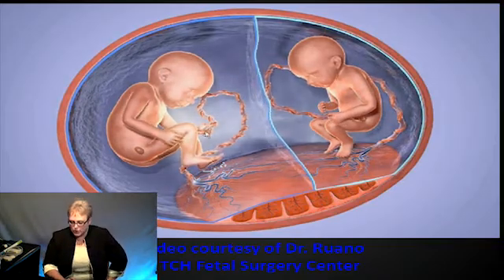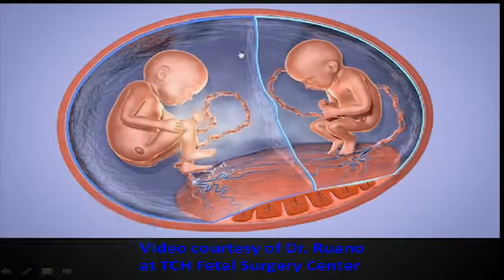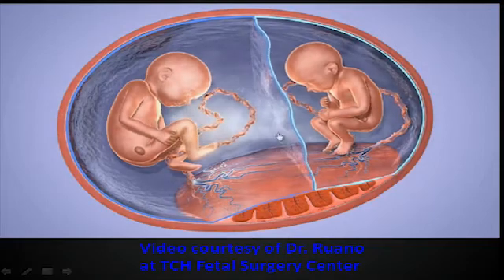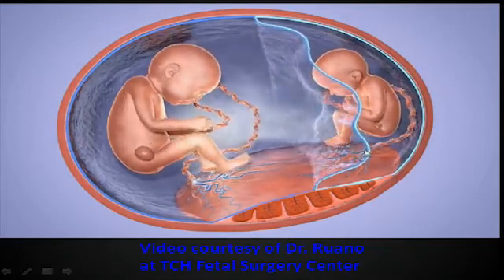So this is courtesy of Dr. Ruano. It kind of shows what happens with our twins. So we can see this baby is going to be our recipient. This one is our donor. So the membrane kind of comes over here and it's pushing that baby over there.